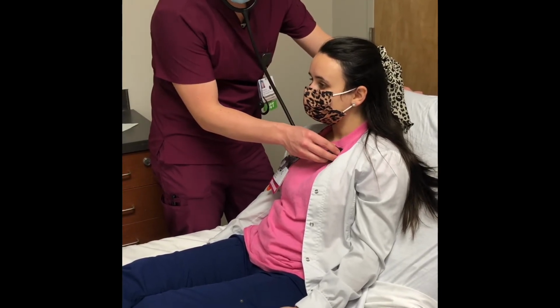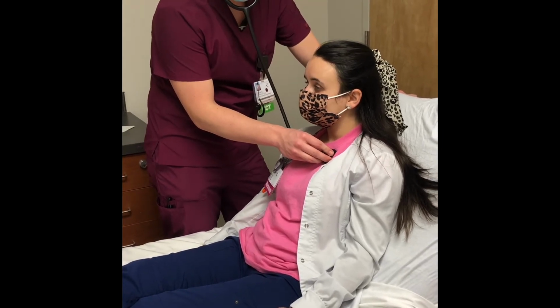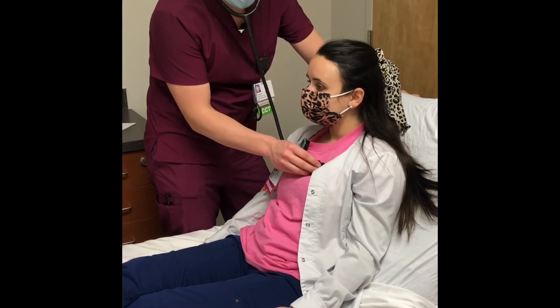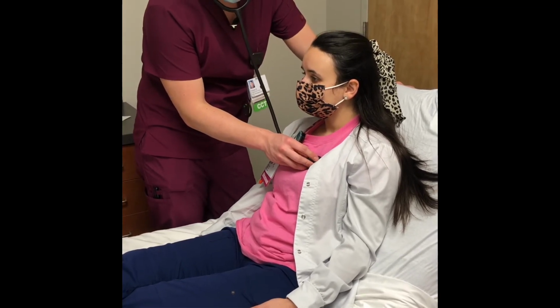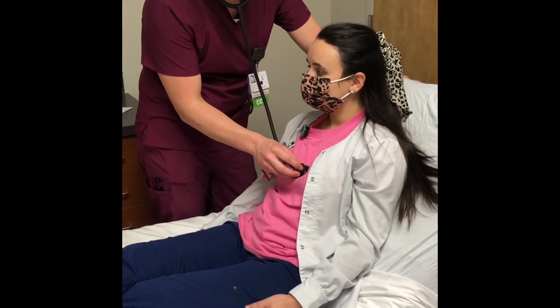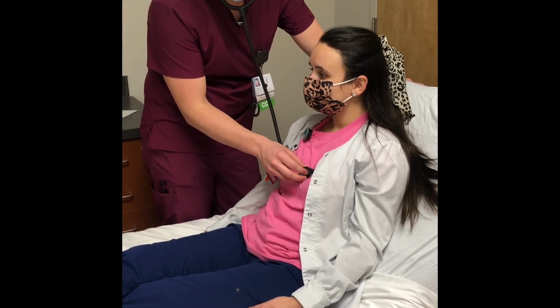Then I'm going to go over to the ridgeline, listen to the pulmonic. Then I'm going to go down, listen to Erb's point. And your tricuspid, and your mitral valve.